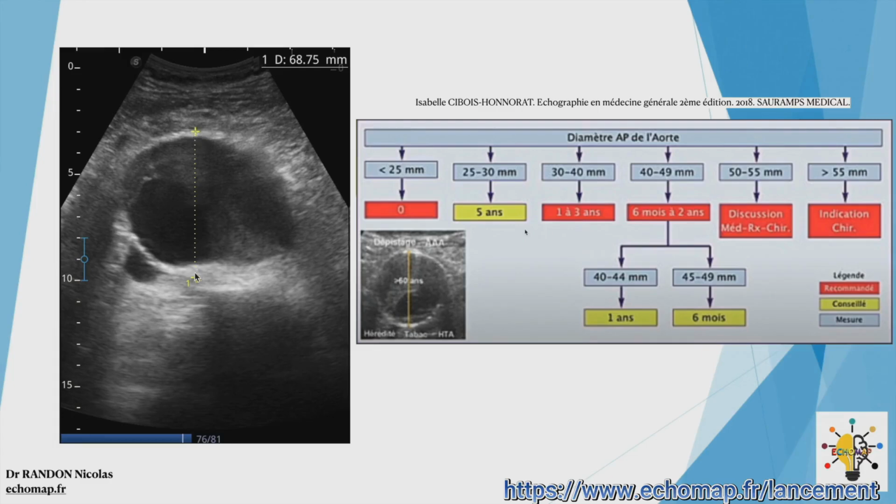When measuring abdominal aortic aneurysms, it's very important. Because if you're only measuring the lumen while that aneurysm is thrombosed, you're in for a ride. Here the lumen is going to measure maybe, we'll say, 3 cm, when in reality the aneurysm here is monumental, measuring 70 mm. This was a patient of mine who presented with abdominal pain.